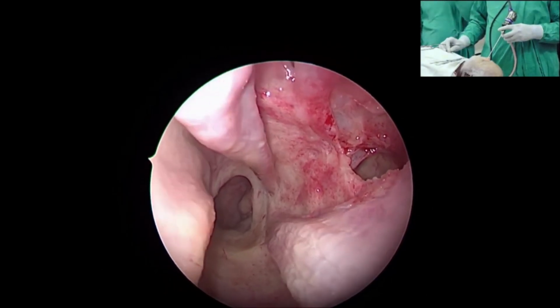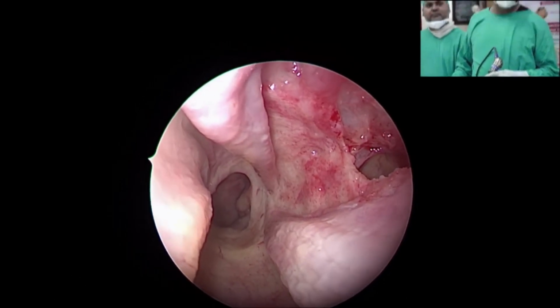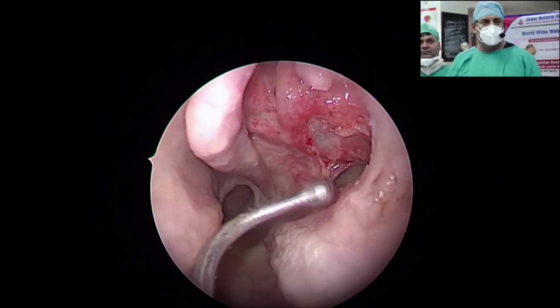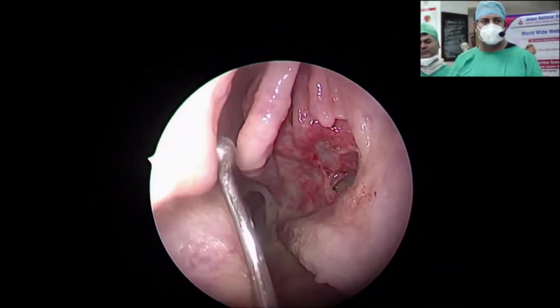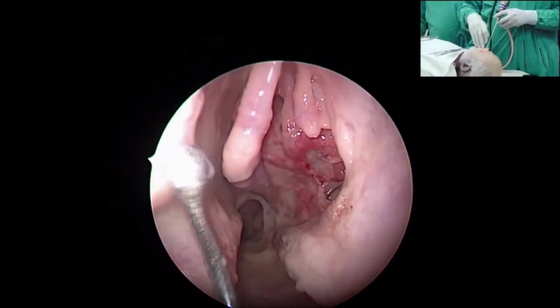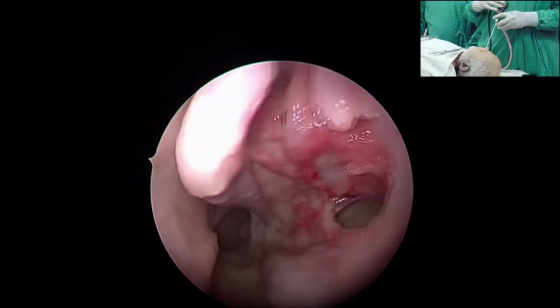So either we go posterior, which most of the time we do, or sometimes a little anterior. Yeah, and that will affect the mucociliary clearance as well. So that's an important point in introduction of the instrument, like Samir has mentioned. See, if we traumatize the opposing mucosas in the nasal cavity, what will happen ultimately, leading to too much crusting and synechias.